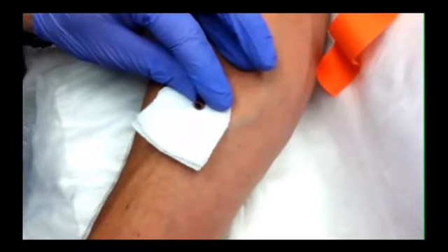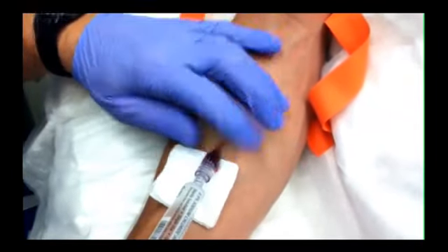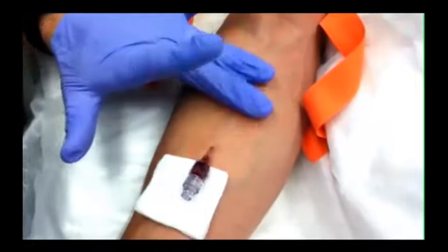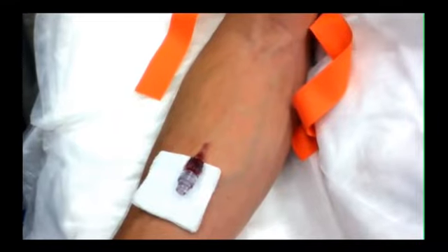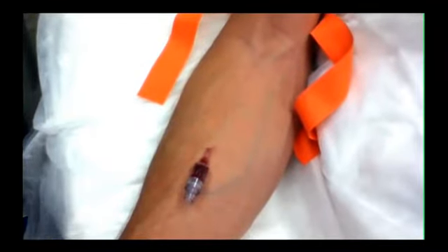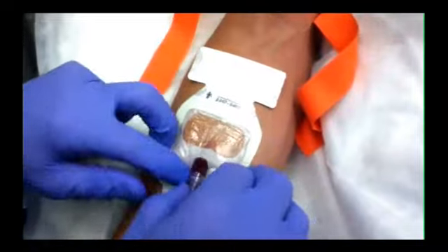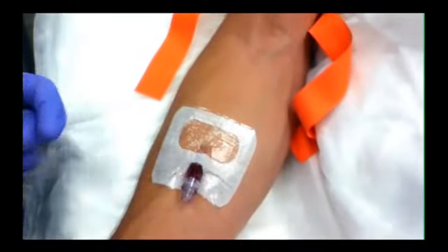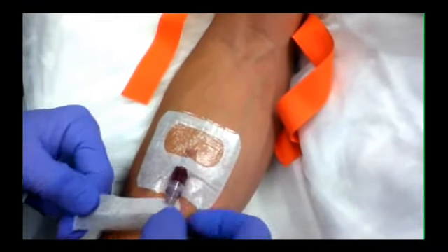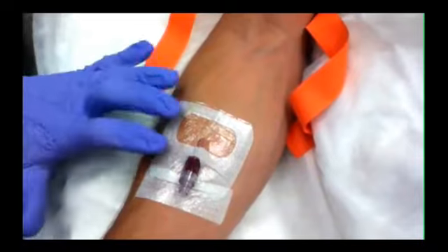I release a little pressure to confirm I have blood coming all the way down. For this example I'll just use the small saline lock hub — twist that on, always draw back a little bit to confirm good flow, and then flush. It flushes nicely and is easy to get at. Take the sharps out of the way, and cleaning around the area helps the sticker stick nicely. We have tegaderms with a window that shows the color of the hub so you can see it easily, and you can see the distal IV site. I prefer a lock strip underneath the tegaderm to hold it down, then sign and date the time and the size of the IV so everyone is aware, and note where it came from — EMS versus ours. That's a peripheral IV in a nutshell.